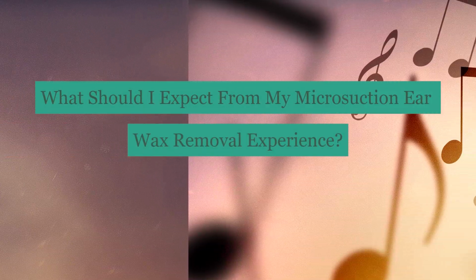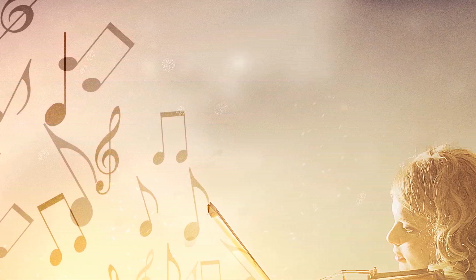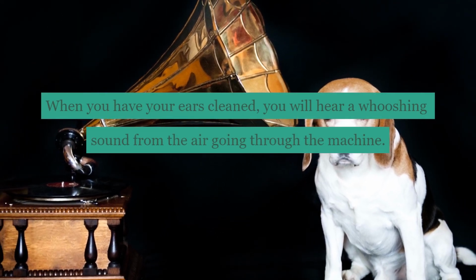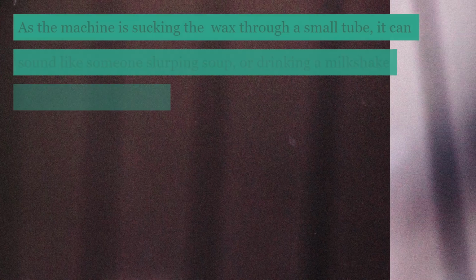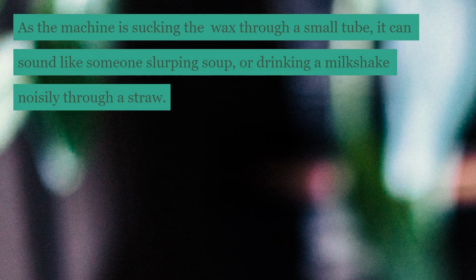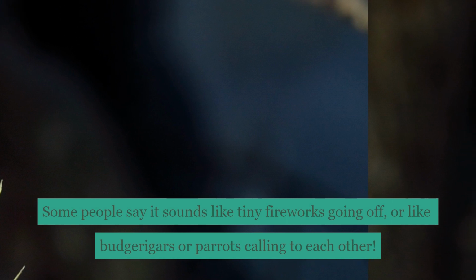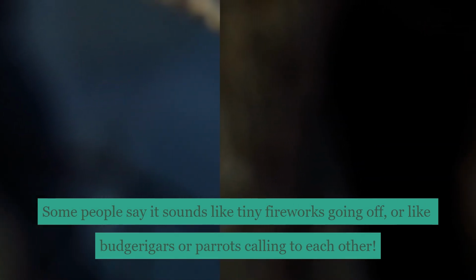What should I expect from my microsuction earwax removal experience? When you have your ears cleaned, you will hear a whooshing sound from the air going through the machine. As the machine is sucking the wax through a small tube, it can sound like someone slurping soup, or drinking a milkshake noisily through a straw. Some people say it sounds like tiny fireworks going off, or like budgerigars or parrots calling to each other.